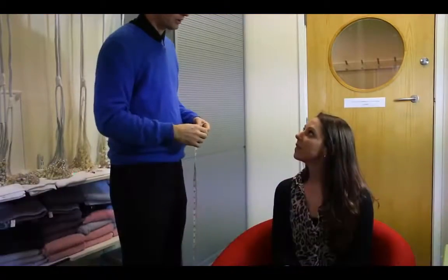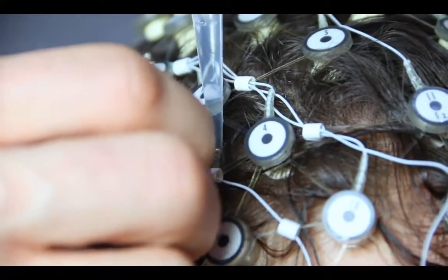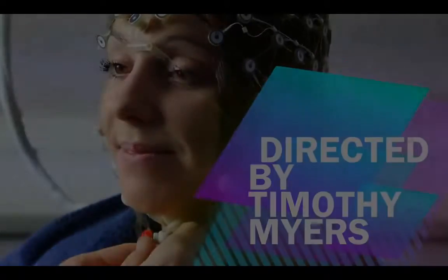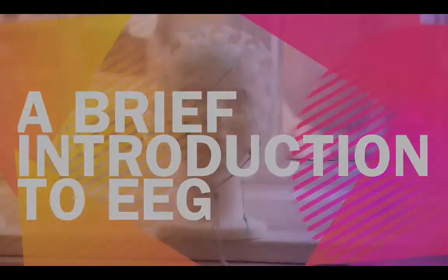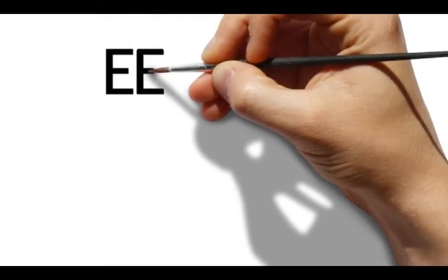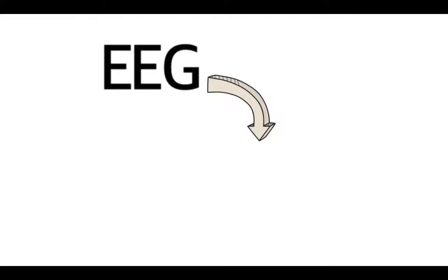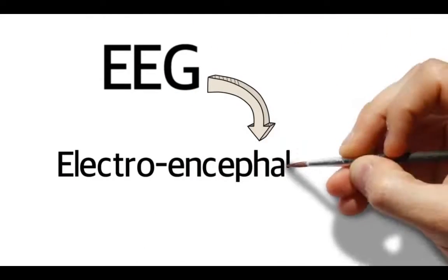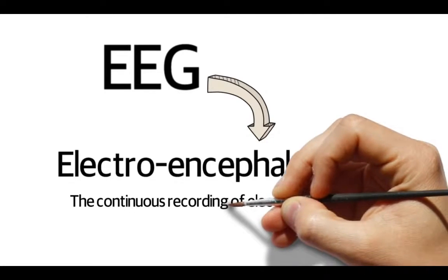Read the electrical impulses your brain is already giving off. Hey guys, welcome to this brief introduction to EEG. So just what is EEG anyway? Well, it stands for electroencephalogram, or electroencephalography. It's the continuous recording of electrical brain activity.